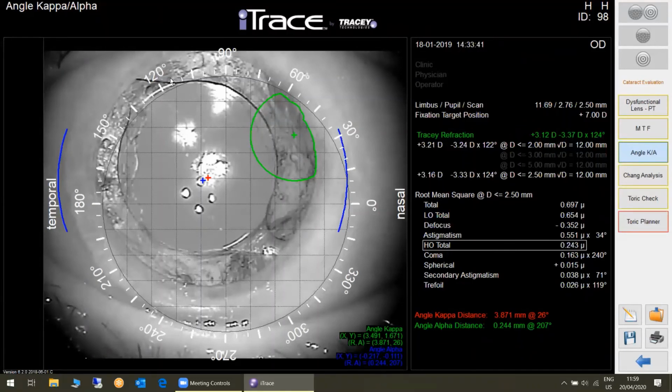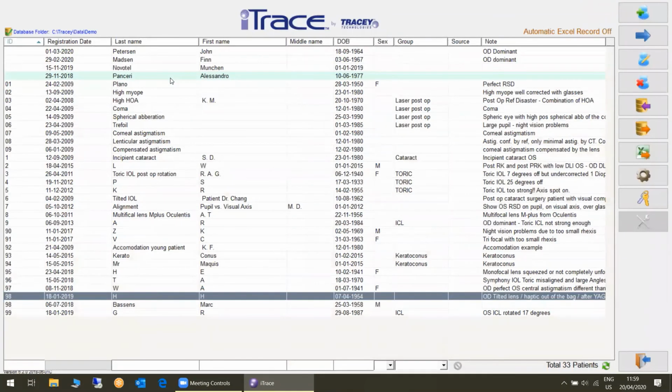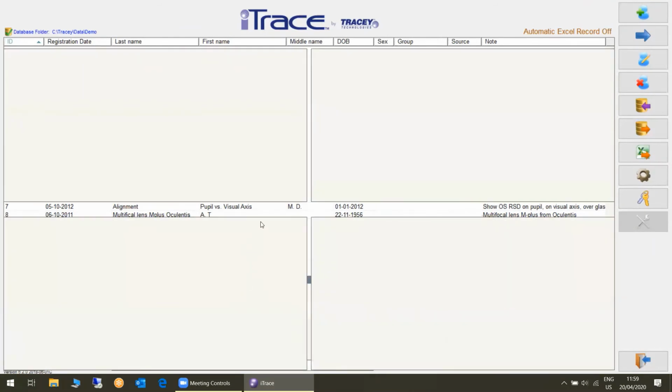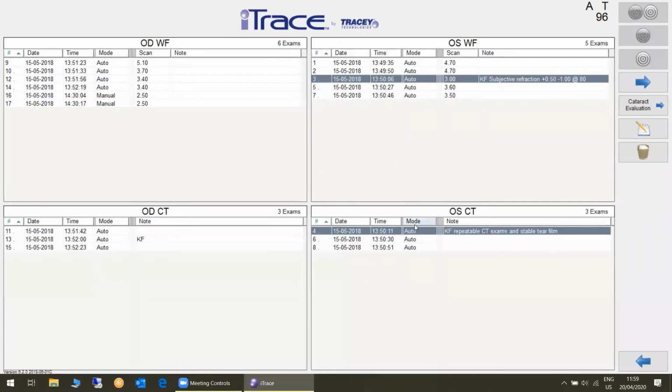Now, if you look at this lens on an OCT or a Scheimpflug image or whatever, you will give yourself a medal because it's so beautiful, but optically it's tilted. So this is how you can really try to understand your difficult patient. And yeah, I have another, I think perhaps some of you are using Symphonies. This is a Symphony toric.